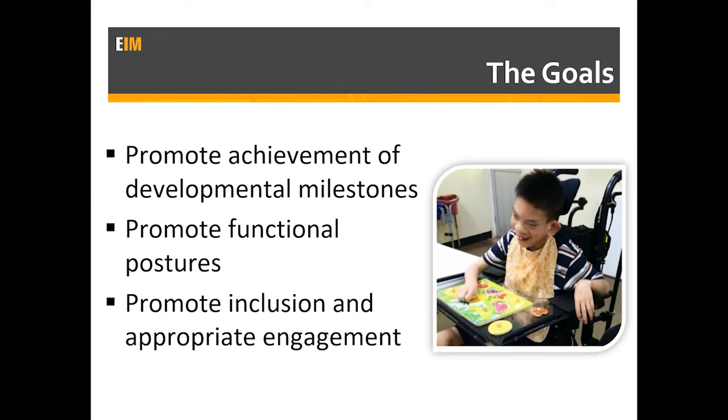The semantics of it, the technique of it is the same. What we're trying to do is the same, but there's some very specific things that need to be considered when we're talking about pediatrics. For one, we know they're going to grow. They're going to change. We also know that there are lots and lots of different people interacting with them, helping them along their way. And each of those different carers or stakeholders, if you will, all have potentially very different motivations and goals.